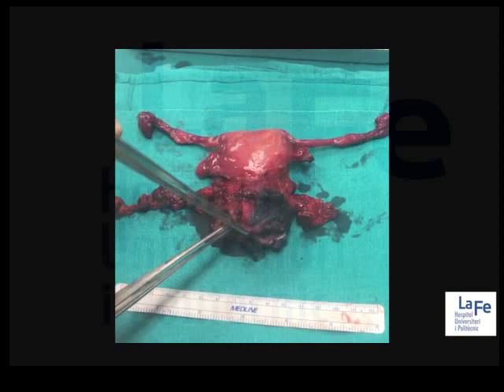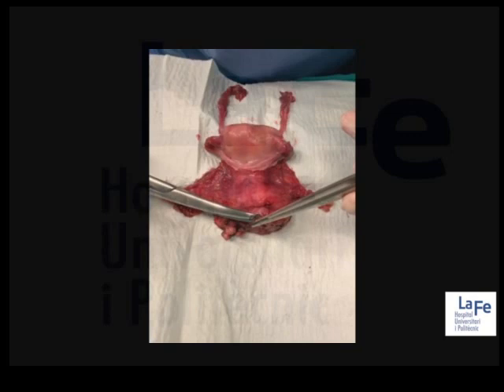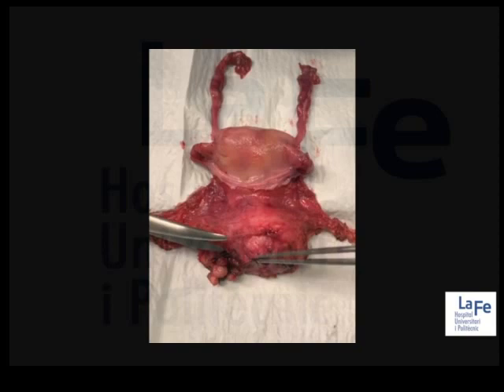This other specimen corresponds to a radical surgery for a patient with a bigger tumor, up to 3.5 centimeters. The same protective effect of the vaginal cuff is appreciated.